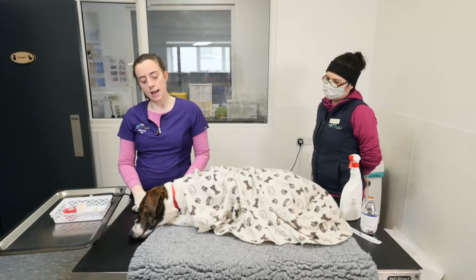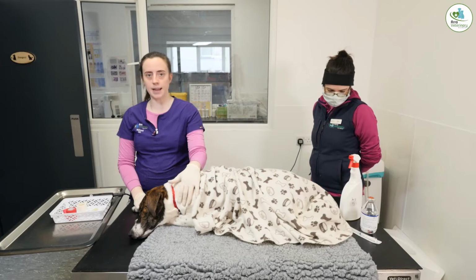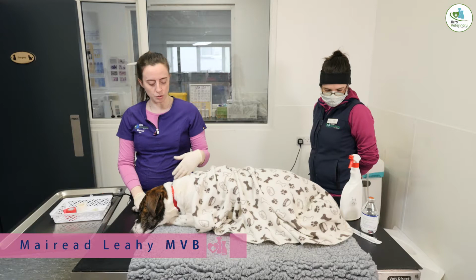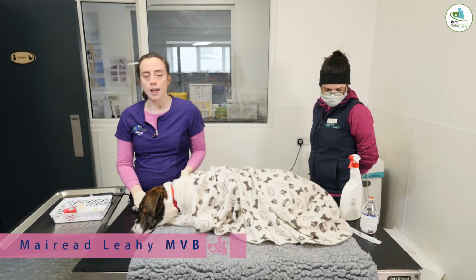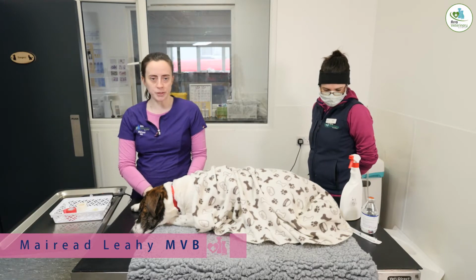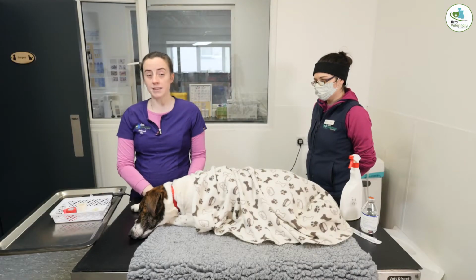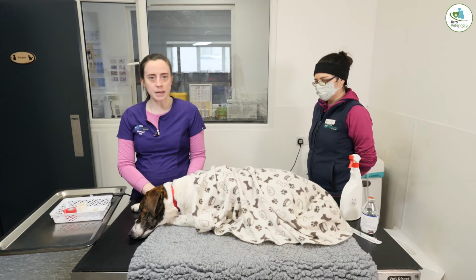So first of all, just a few reasons why we place the cannula in pets when they come into us. One might be that they're coming in sick and they need a drip. So by placing a cannula, it's a direct intravenous line for fluids. We always place the cannula if any dog is getting sedated, operated on, anything like that, any procedures at all, to keep them safe. So we want to be able to administer emergency drugs. Also, if the pet is a little bit uncomfortable, we can top up their pain medication. So basically it's a safety net for us to have this direct access into their vein.